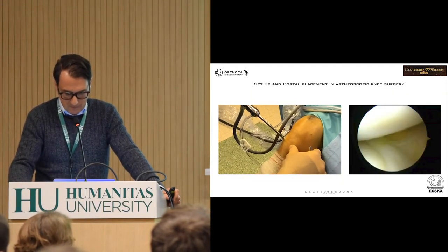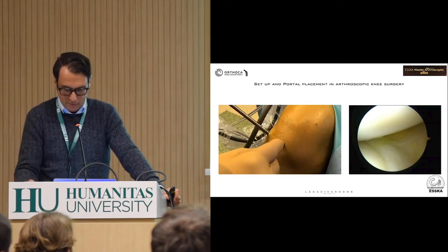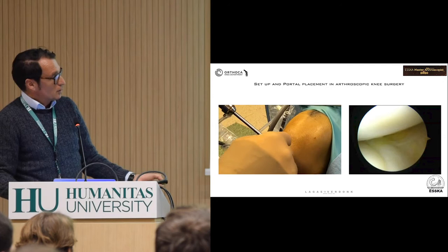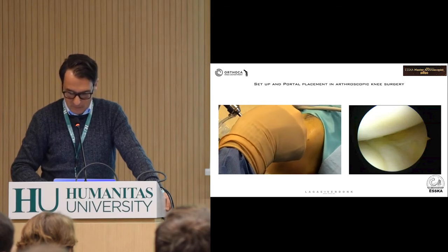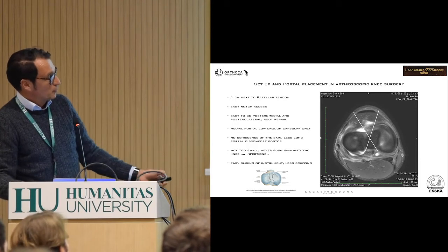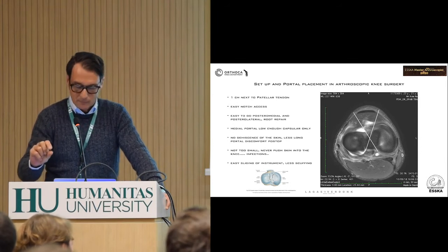The other portal, the medial one. I keep the foot on my knee — don't give out the stress. First the skin, and I'm going really straight forward. Don't go to the center; the center is the notch and you want to come next to it. If you're young or less experienced, use a needle to show you the right spot. My knife comes in the joint and I turn it around with the meniscus and I come out. That's how you make it easier — it makes it so much easier.